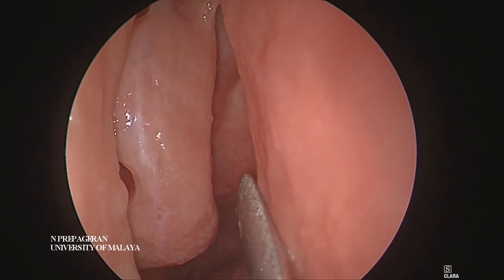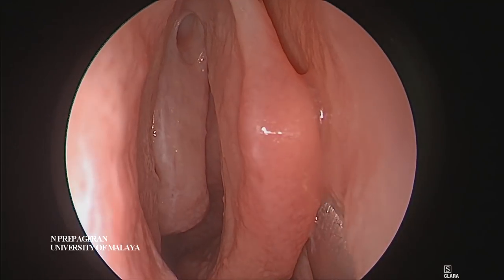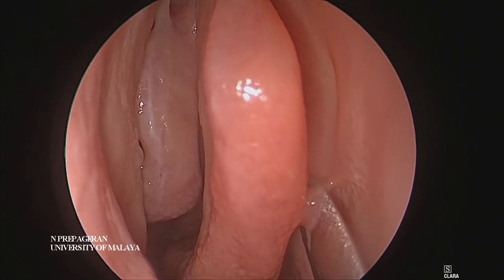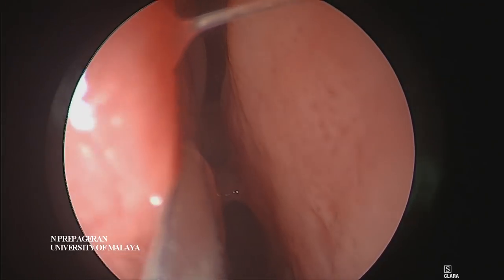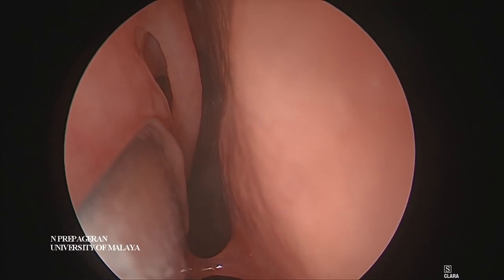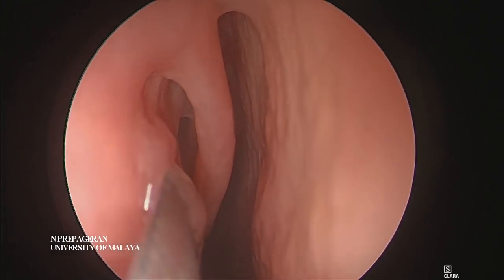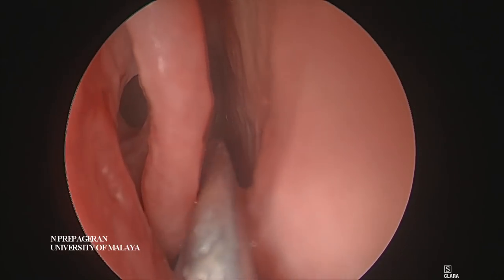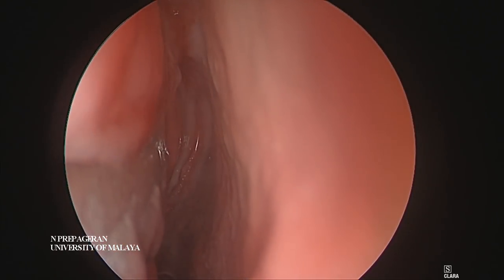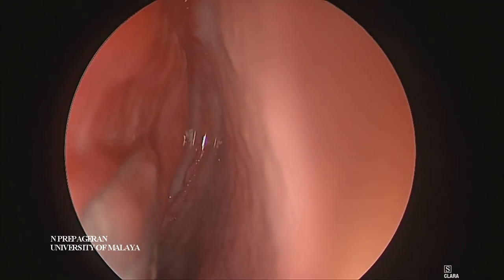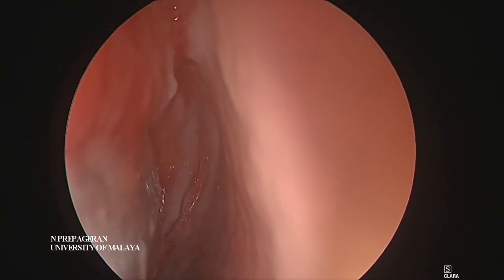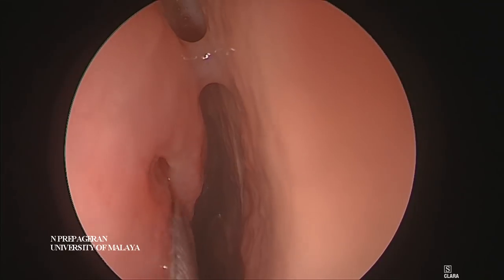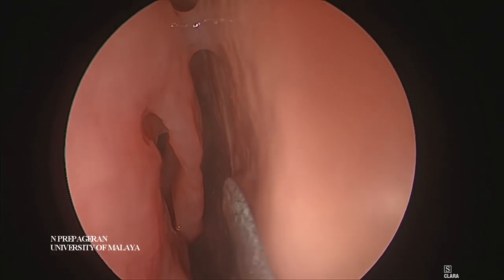So based on this, we know the configuration of the anatomy quite well. If we want to do a sphenoid surgery through the natural ostium, all we need to do is gently move the middle turbinate away. And we can see the superior turbinate there. The superior turbinate is where the posterior ethmoids open up — that's probably the ostium of the posterior ethmoid region. And then if you gently move the superior turbinate medially, this patient has got a supreme turbinate as well, a small one, and that should be where the sphenoid ostium is. In this case there's probably some obstruction and you can't see. So this is how we actually go to identify the sphenoid ostium in a natural manner.